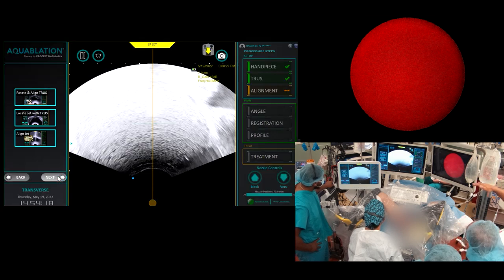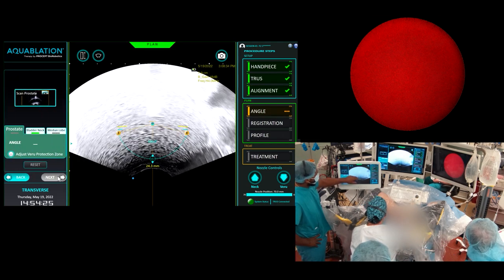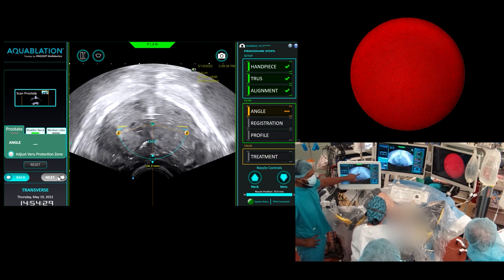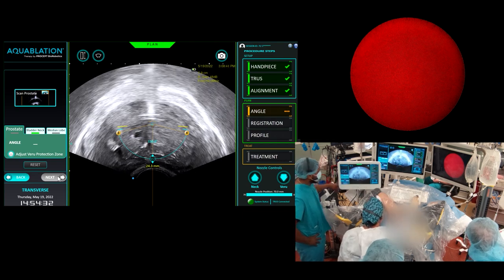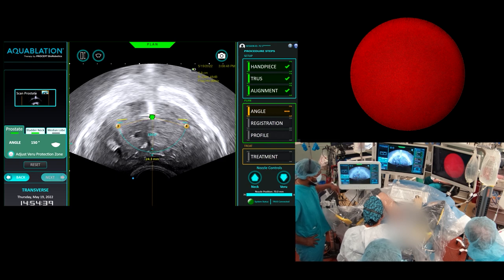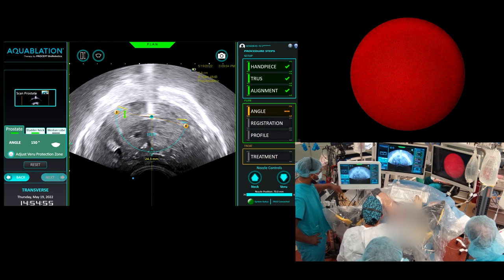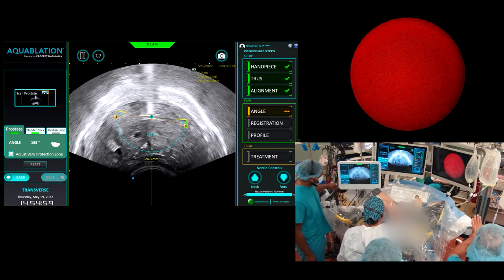Step again. I think we're there — I can see it. If we want to visualize what three and nine is, bring up your green line to see it shooting off at three and nine — the jet. But if you visually see it at three and nine, you can leave it as is. For this step, you want to put the marker right in between our water jet and the aspiration. I'm going to move this up — look at that yellow line right at the capsule. That's the most outer boundary. You're just moving the dynamics up in the water jet. Come down one. Not moving anything else — moving the angle. Everything else is stationary. You're only ablating tissue below.